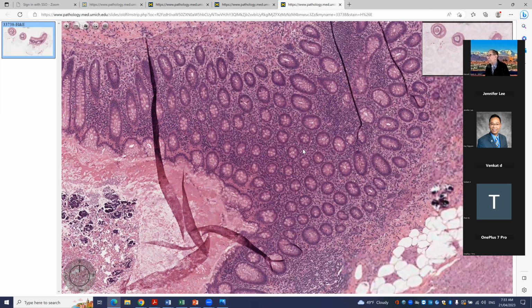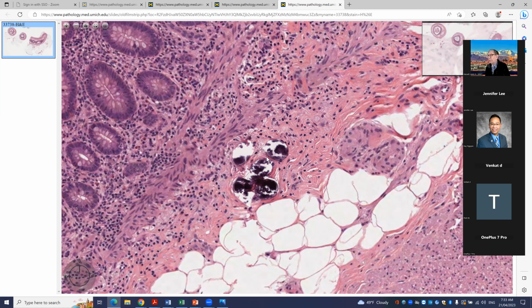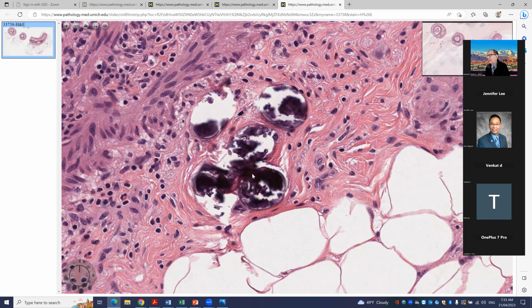And we look at some of these. These are clustered, they're fairly uniform in size, but they also look calcified. But notice that we have a little bit of a rim around this, as you can see. A little bit of internal scalloping and variability. So kind of hard to pick out for sure, but I suspect, Sahar, you know exactly what this is. Well, Venkat, you know as well, schistosomiasis. Very good.